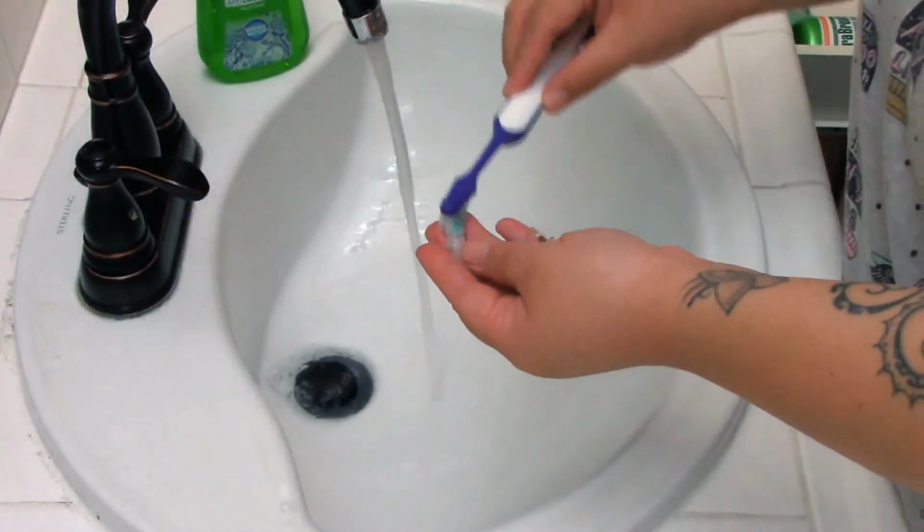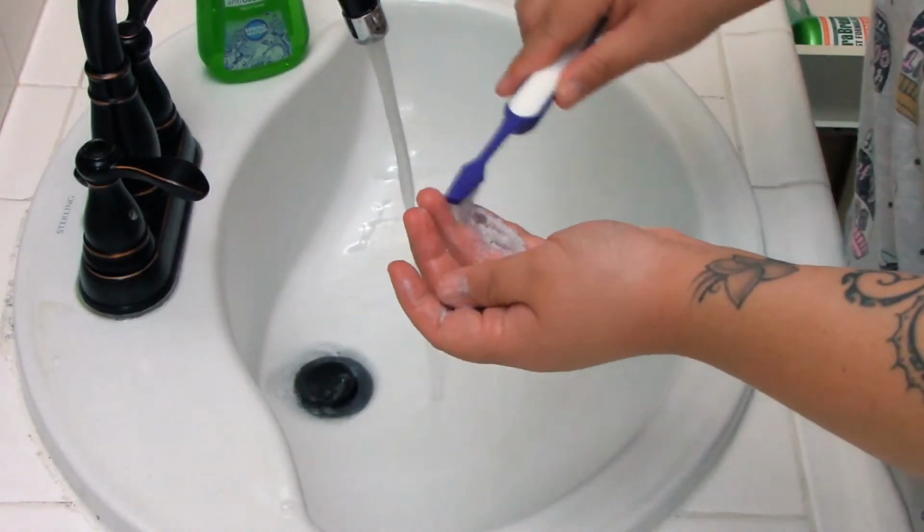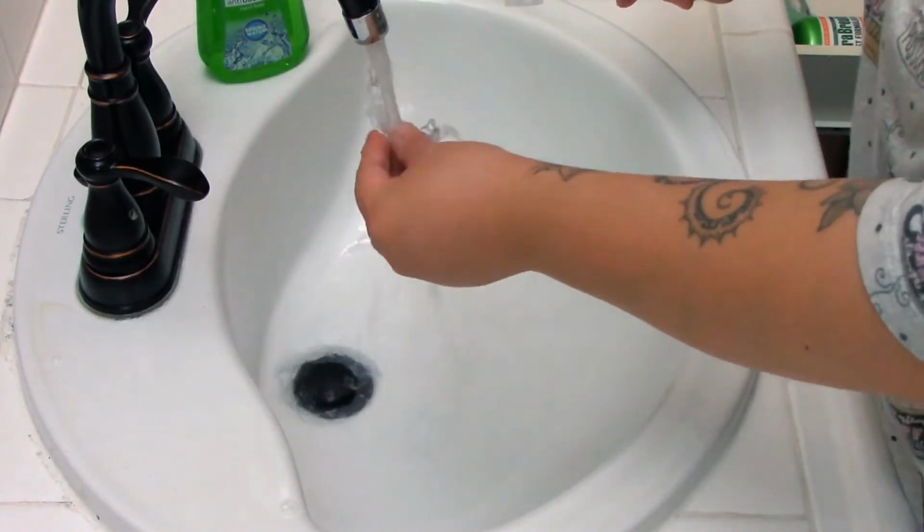Alright guys, so my second set is on and I will be with this set for the next 2 weeks. So here's my cleaning routine while I've been on Invisalign. I wake up and remove my Invisalign trays, and I clean these trays twice a day, once in the morning and once before bed. Just take a little bit of toothpaste and my toothbrush and scrub them gently.